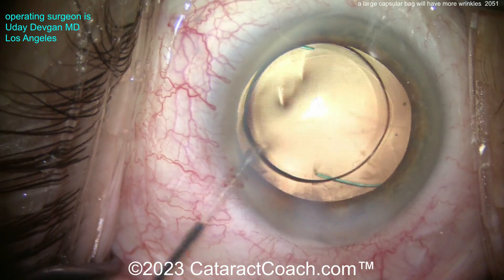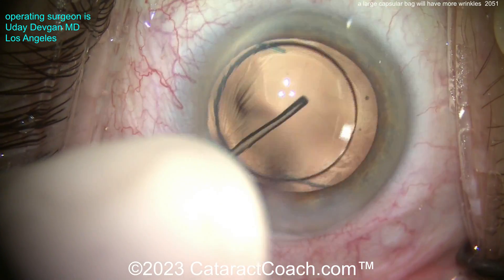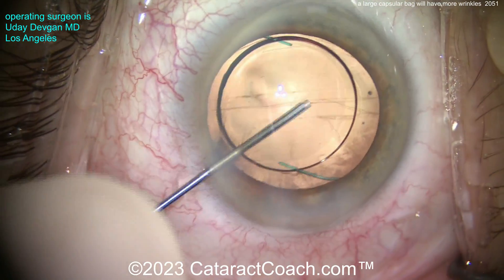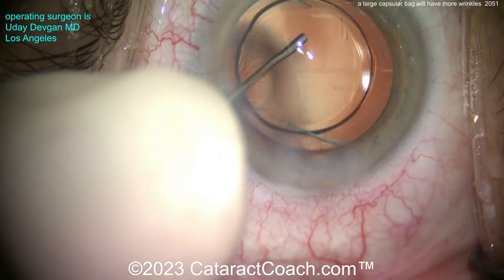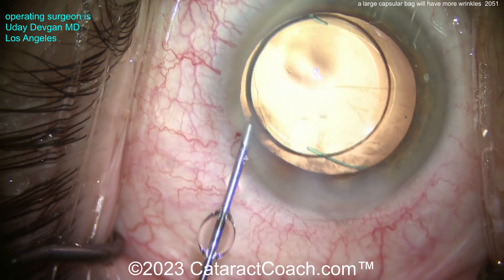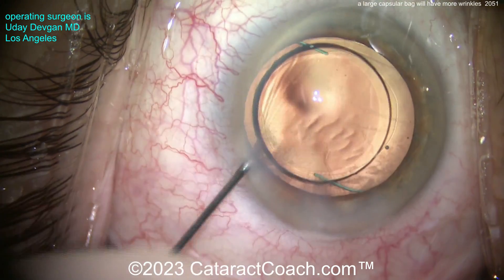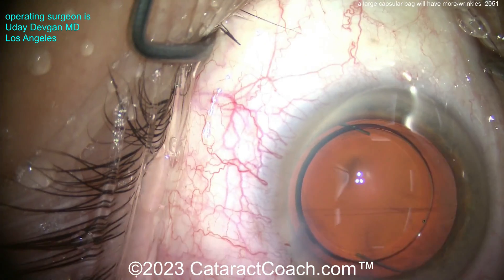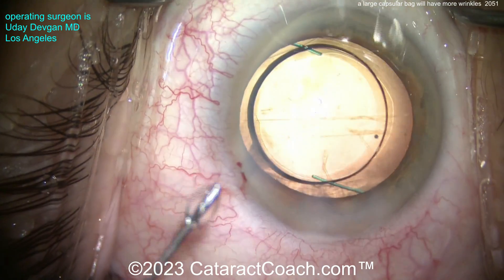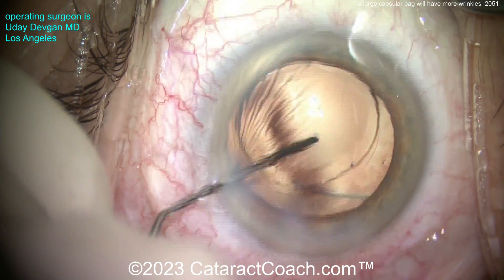But is there another way? I'm sealing up the incisions here. Now I'm going to push the wrinkles to the side of the optic — right there in the middle we don't want them. We want them to the side. If we scoot the optic over a little bit, we can make the wrinkles go more to the side. I'll get the eye filled again — nice deep bag. Now you've got any wrinkles or laxity on the side. Look at the top of the haptic-optic junction — still a little bit more wrinkles.